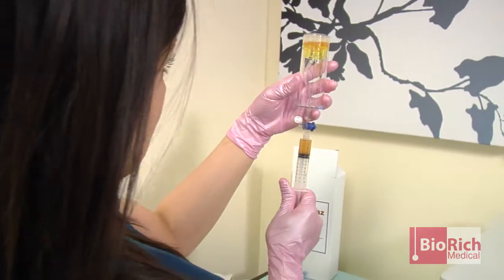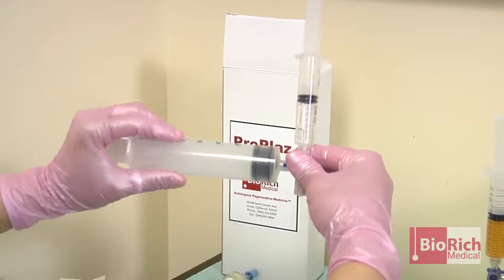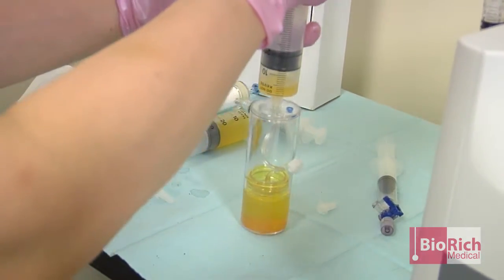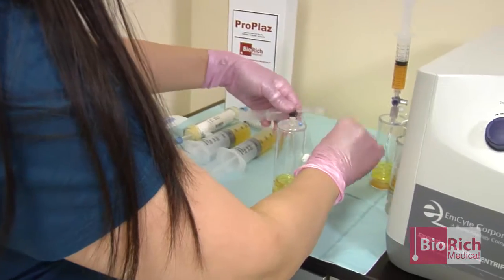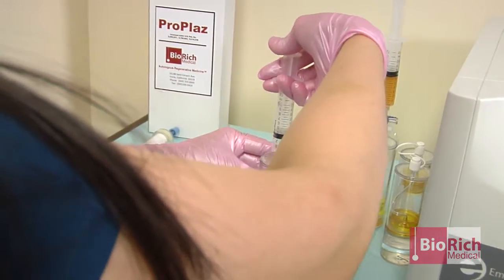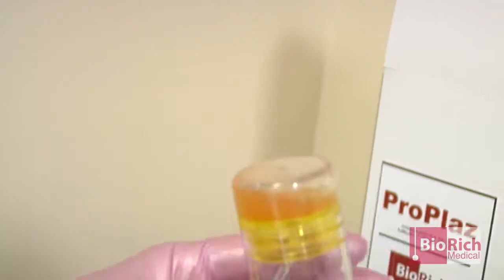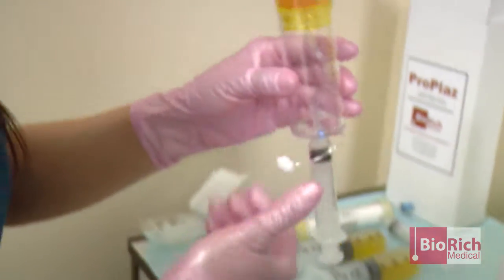So now we have the PRP result here. On this one, we are not going to use the stopcock — I can show you that you could do it either way. Just put a 60 cc syringe and take the PPP. So this is a PPP. Now I am going to add the syringe with the air. The air helps to capture the sticky platelets at the bottom of the chamber. Now we can mix it. You can see that the platelets stuck at the bottom are now mixed with the PRP. The PRP is ready to inject.